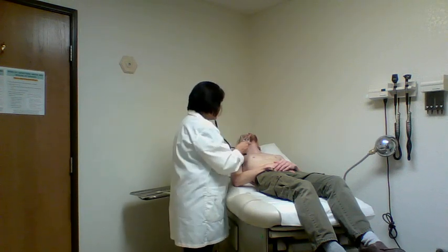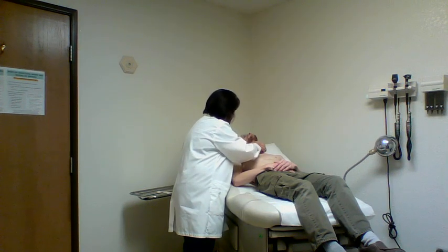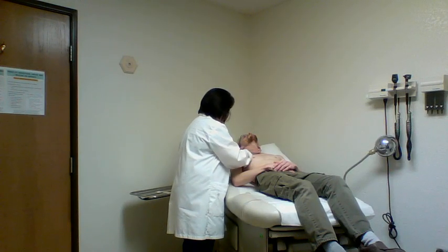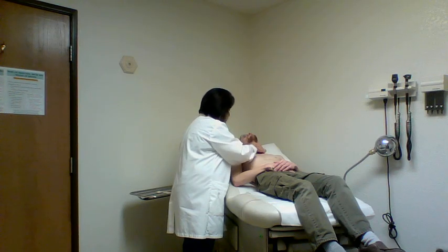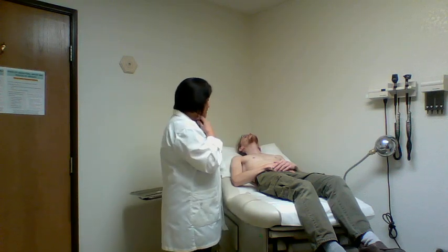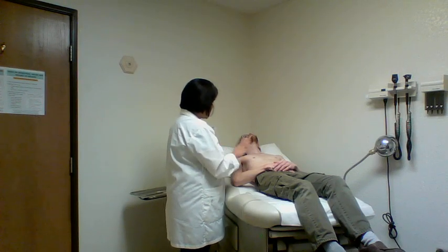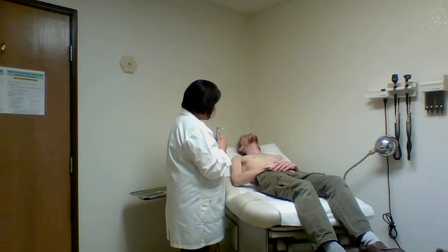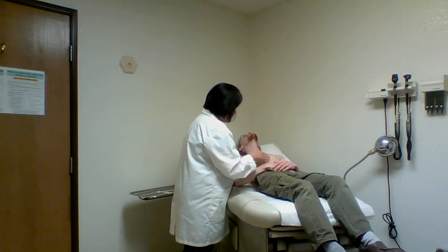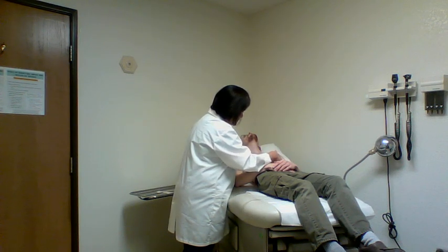First, using the diaphragm. And the bell. So there's no bruit. So on examination, moving on, his chest, there are no abnormalities. I don't see any heaves nor lifts. On the point of maximal impulse, I can feel it here.